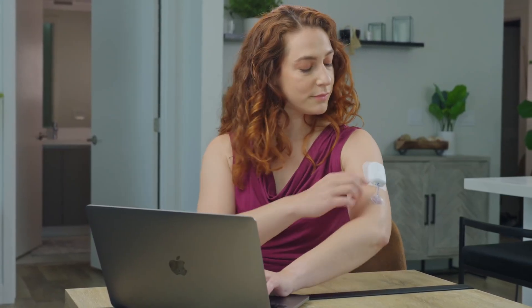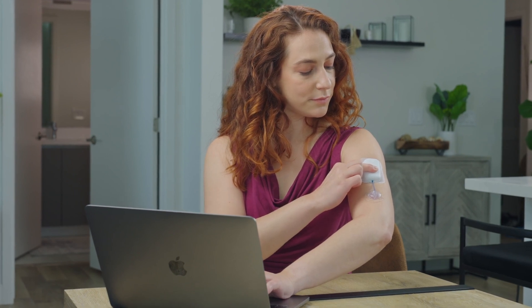Feedback from the pump can easily be heard and then confirmed with a press. By pressing the control button for an extended period, you can put the pump in basal suspended mode for 30 minutes. A unique tone and light indicate the device is in delivery suspend mode.